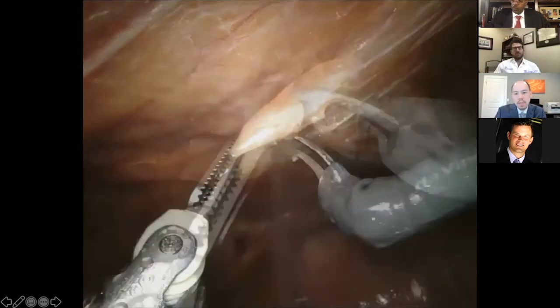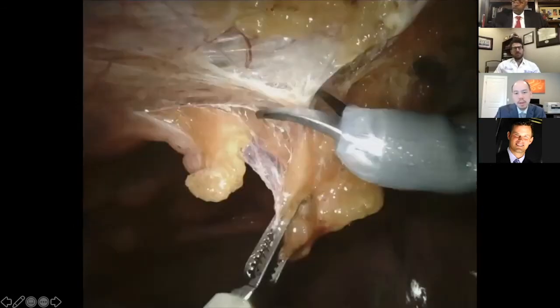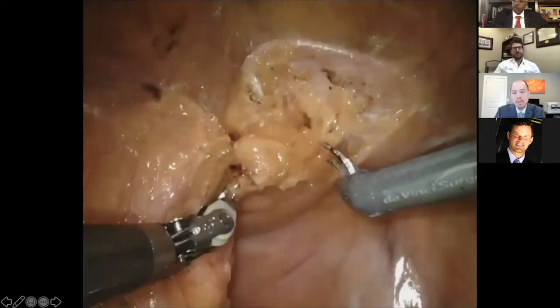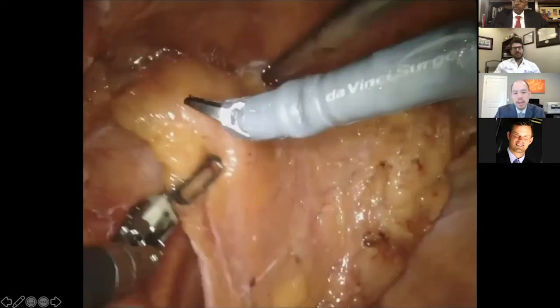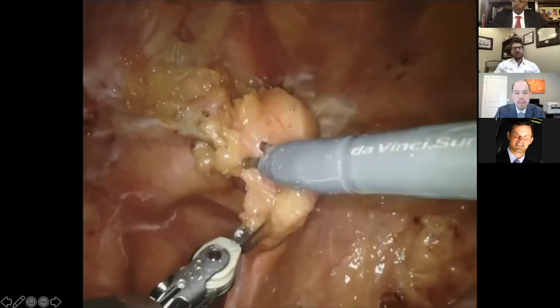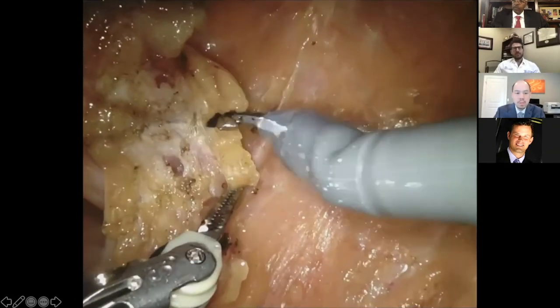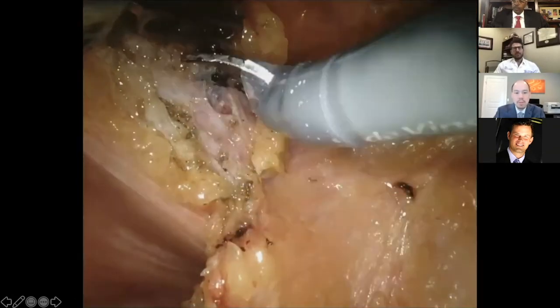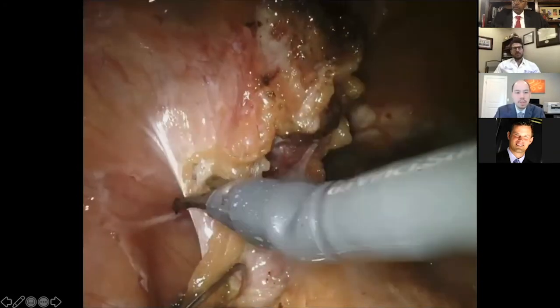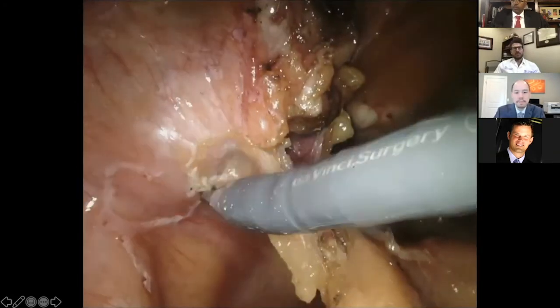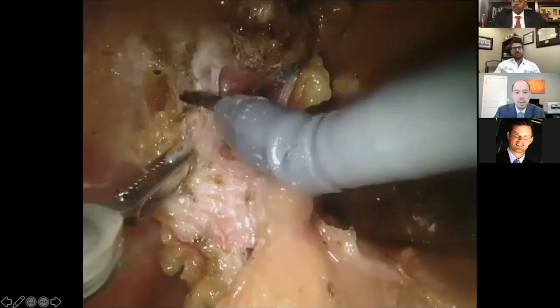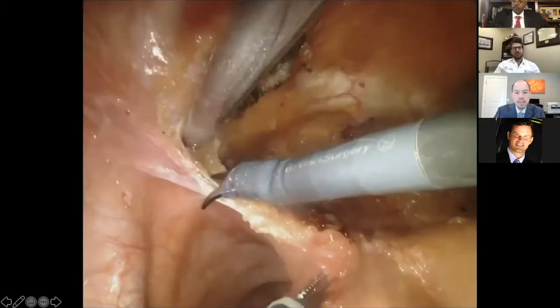In this next case, I'll show you a patient who's had bilateral inguinal hernia repairs with mesh, which presents a slightly different challenge in mobilizing the bladder. On the right-hand side, you can see the mesh starting to come into view — it's adherent to the paravesical fat but fairly easy to separate. On the left, there's a bit more mesh and it's actually adherent to the bladder wall. Most of this dissection can be done with electrocautery, though some areas are pretty stuck, so we'll do this sharply and then proceed with cautery to clear the bladder off the mesh.